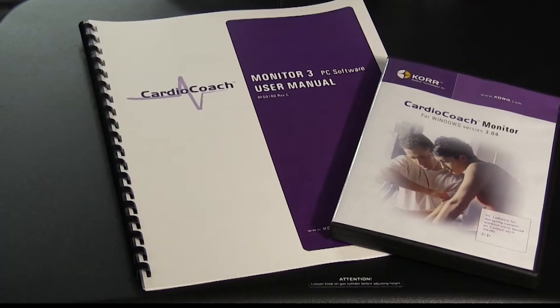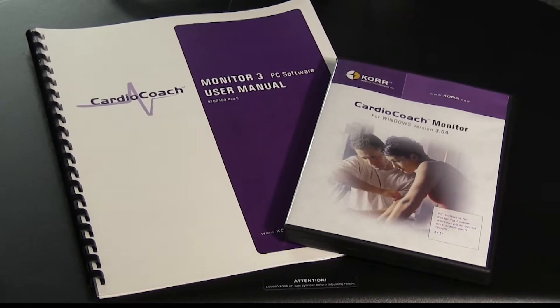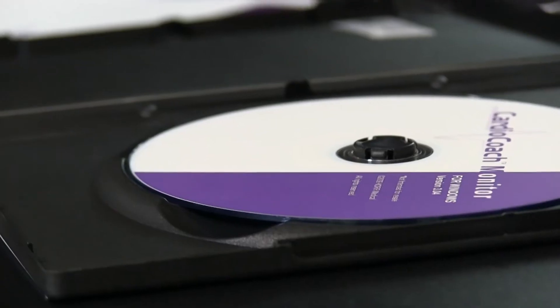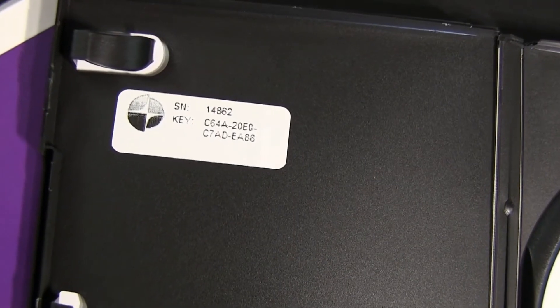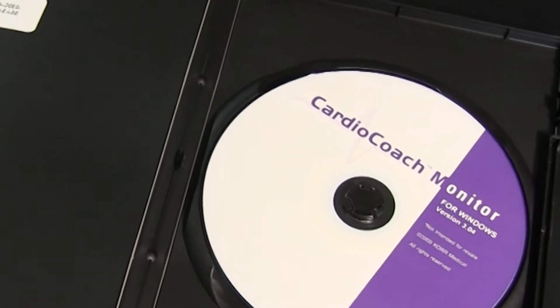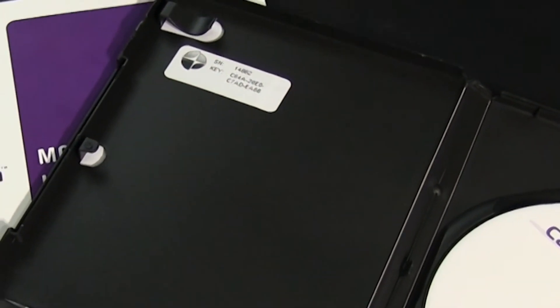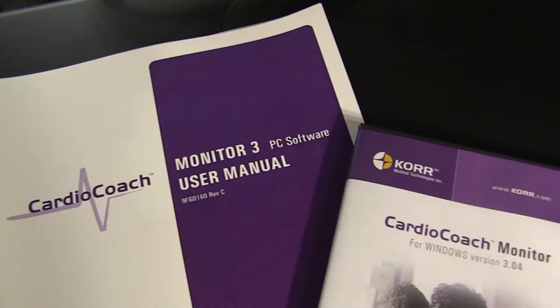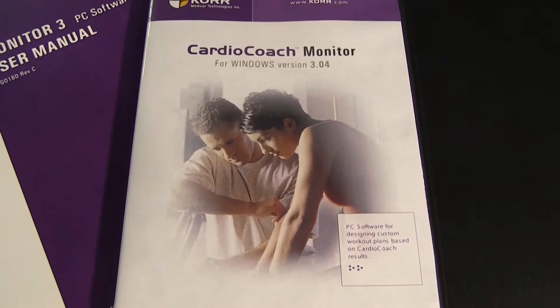If you have purchased the CardioCoach monitor software or if you are using a CardioCoach CO2, your unit will include a CD case with a copy of the software. Inside this case is a registration code that is unique to you. There are occasions when a power surge, Microsoft critical update, or change of computers will require you to re-enter this registration code. You will want to save the case or the number in a safe place to keep it readily available.